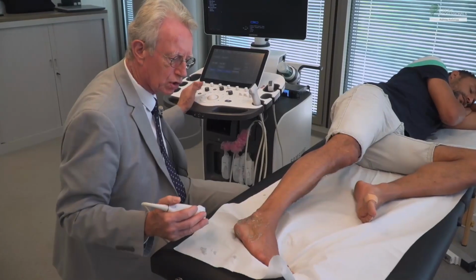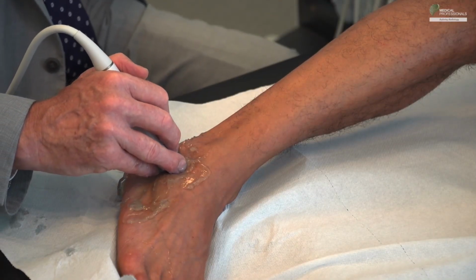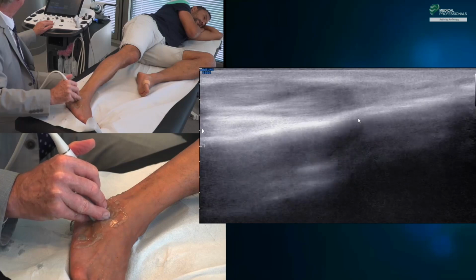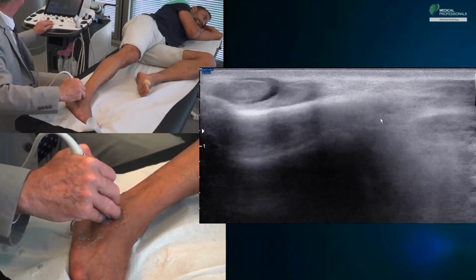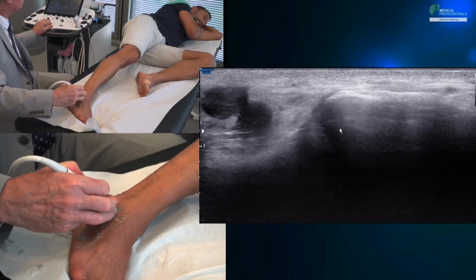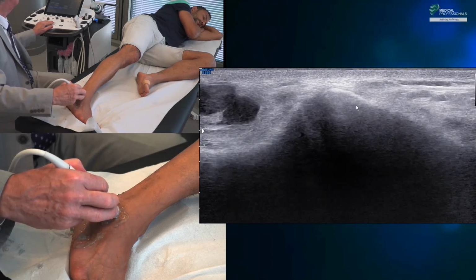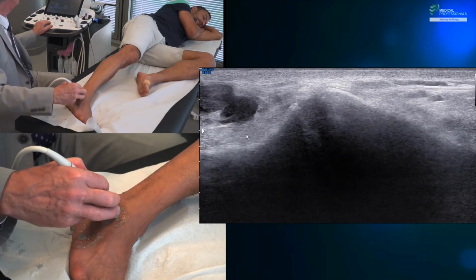Another thing to remember is the lateral subtalar space. By making a section showing the peroneal tendons, we should know that in this same section, by positioning our probe submalleolar, the lateral subtalar space between the calcaneus and the talus anterior, with the peroneal tendons and the calcaneofibular ligament, is in depth of these tendons.